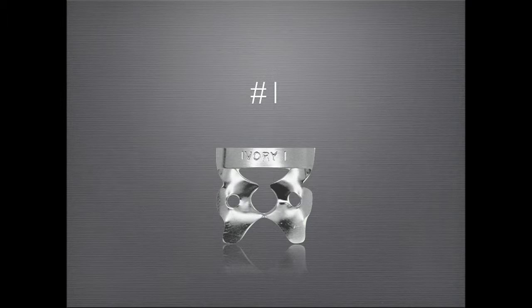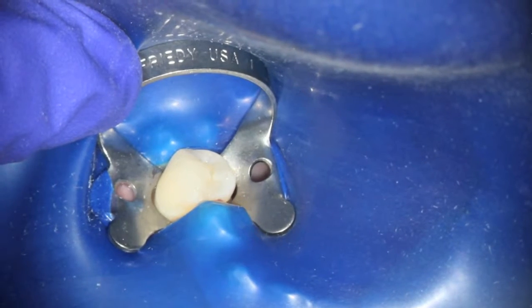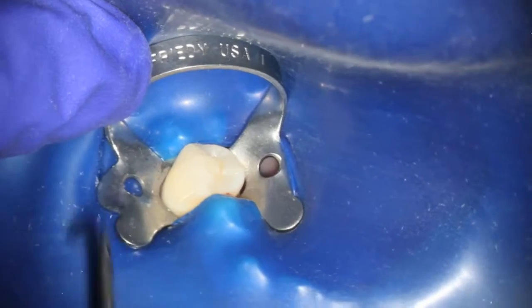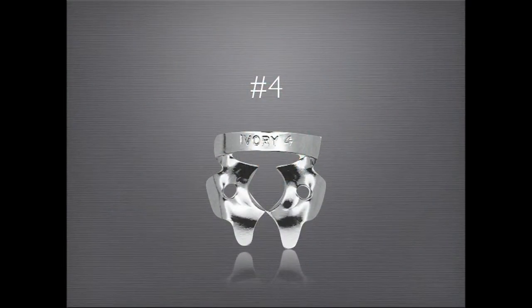The number one clamp works great for bicuspids, small molars, and prepared molars. It is placed in the following manner. The number four clamp is my clamp of choice for virtually any molar tooth. It may also be used for large bicuspids. This is an example of how I place the number four clamp.